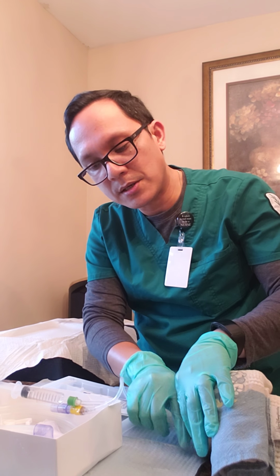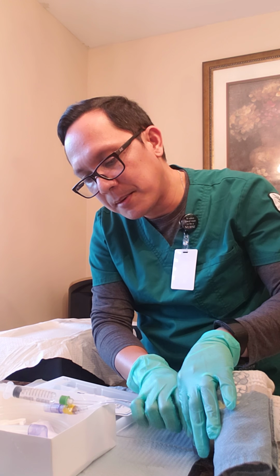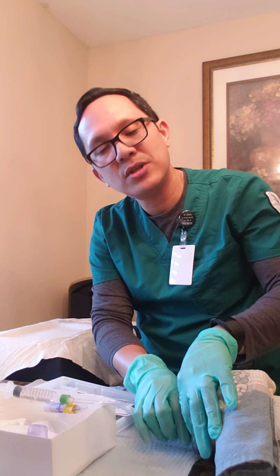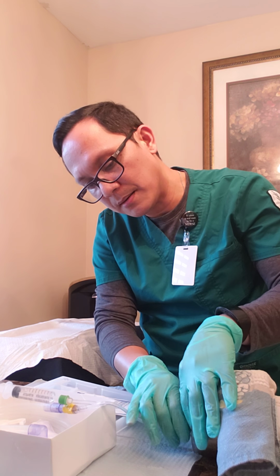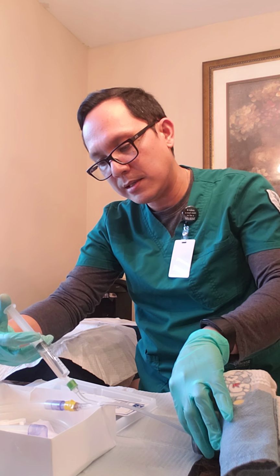Once we start inserting the Foley, I'm going to advance until I see urine coming out of the tube. Once I see urine coming out of the tube, I'm going to advance 1 to 2 inches more just to make sure I have an area where I can inflate my balloon. Once I'm done with that, I'm going to hold the Foley with my non-dominant hand and inflate my balloon slowly.